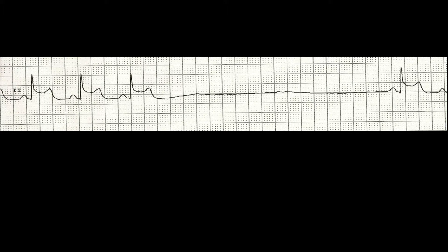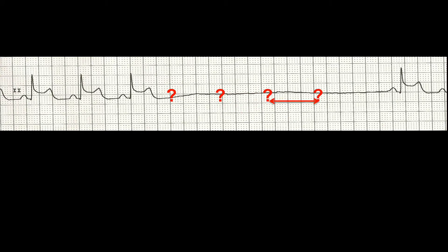Here is another example of ST elevation inferiorly. At the beginning of the tracing, the PR interval is normal and the QRS is narrow. Marking out the atrial rate to establish the PP interval, we can then see going forward that there is a P wave that should be there but is not — and again, no P wave, no P wave, no P wave. Therefore, there is evidence of sinus node disease in the context of an inferior STEMI, meaning the blood supply to the sinus node has been affected. However, there is no evidence of AV nodal disease, as the PR interval is normal and the QRS has remained narrow.